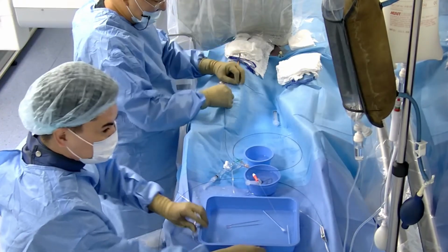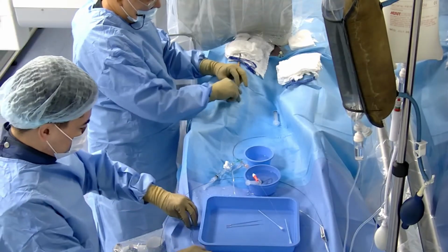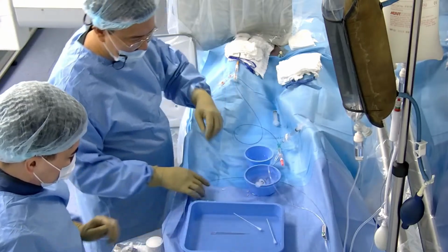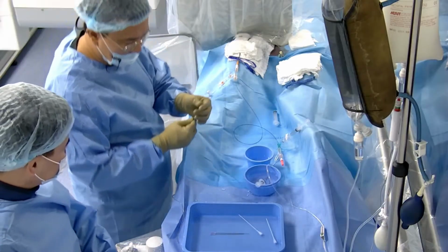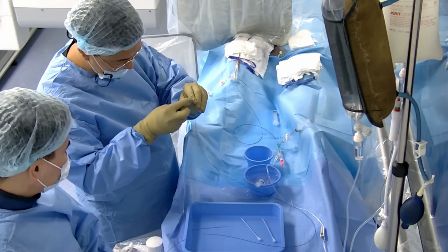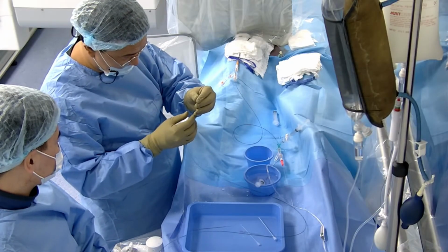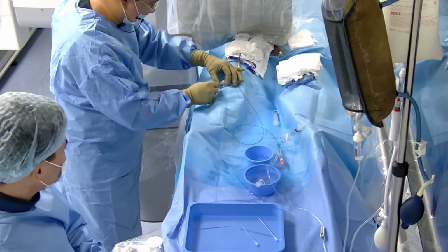Through the 7 French Fubuki, we asked Madina to give an Eclipse double lumen. It's for assistance and for possible stenting. For the coiling, I asked to give us Headway 17. Maybe in storage we have a little bit more Headways, but till now it's the last Headway 17 for today.